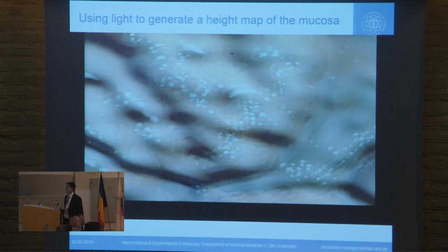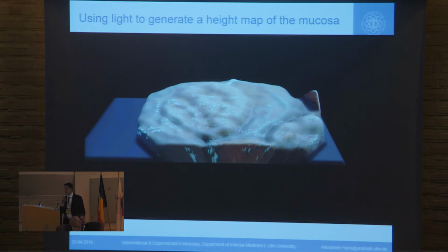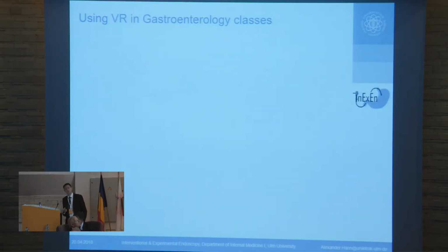This is one step further to perhaps one day measure things, because I think it's very important in endoscopy that we are able to measure things inside the colon or the stomach. So 3D reconstruction is one step in this direction.